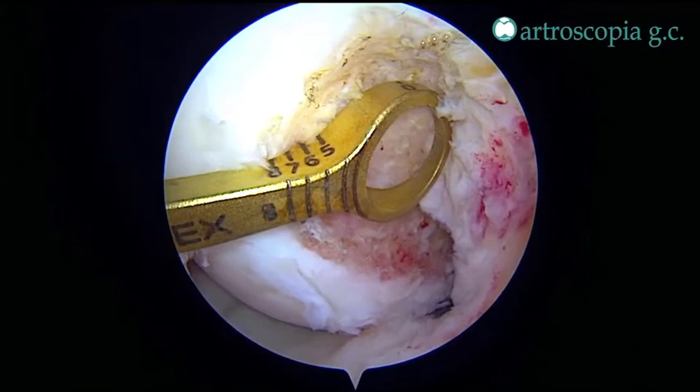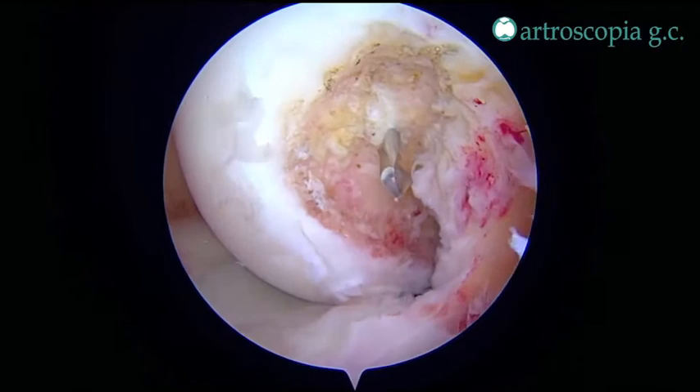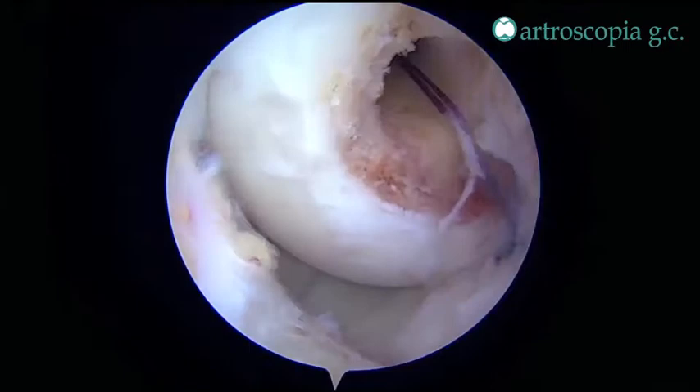The PCL femoral guide is positioned so that the center of the guide is 8 mm away from the bone-tendon interface, and the same drill is advanced outside-in along with a 10 mm reamer to create the femoral tunnel.